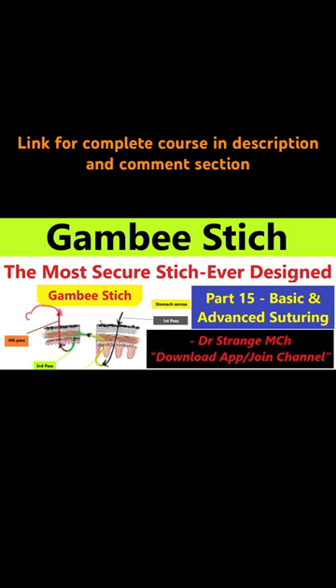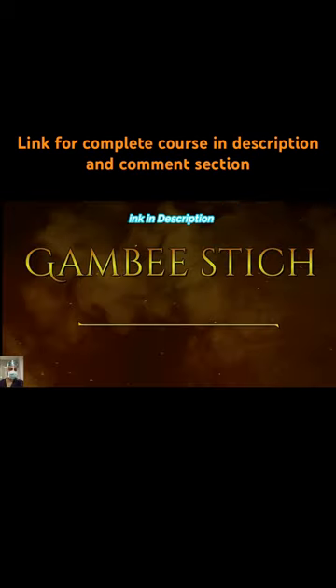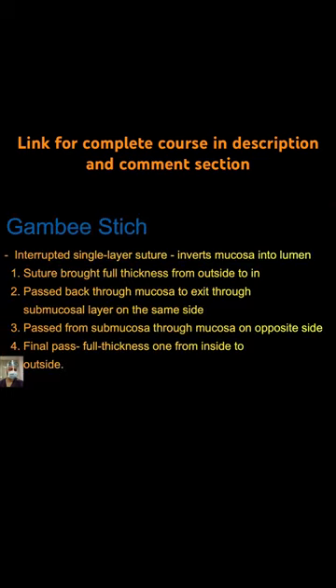Today we are delving deep into a technique that is a game changer in the world of suturing — the Gambee Stitch, in both basic and advanced suturing. The Gambee Stitch is an interrupted single layer suture.